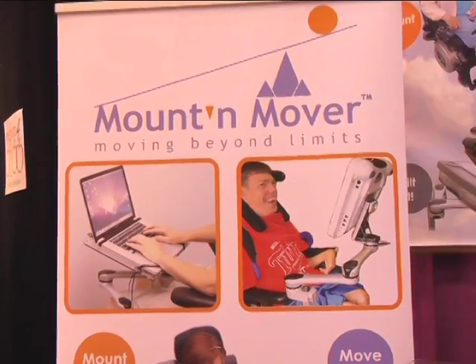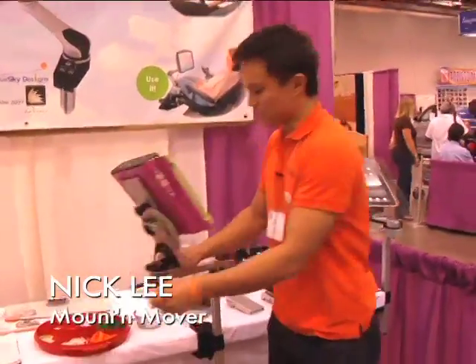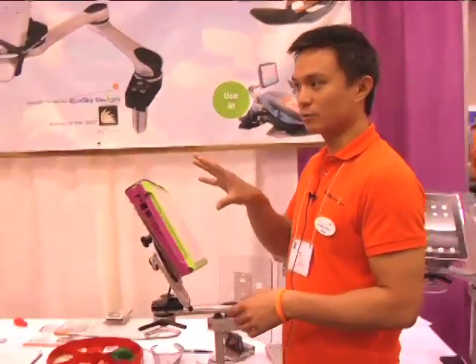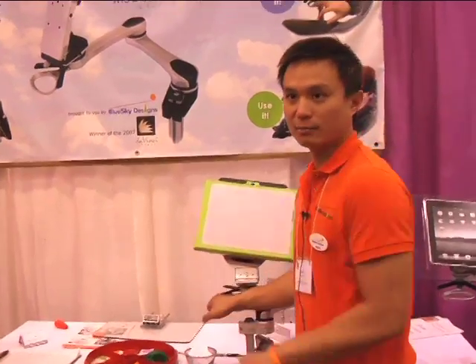Hi, I'm Nick Lee from Blue Sky Designs. We developed the Mount'n Mover — it's a brand new wheelchair mounting system. Consistent positioning is such a big deal, and in a lot of these situations getting your device at the right position is so important. So repeatable positioning, and yet you can still take it and move it out of the way.